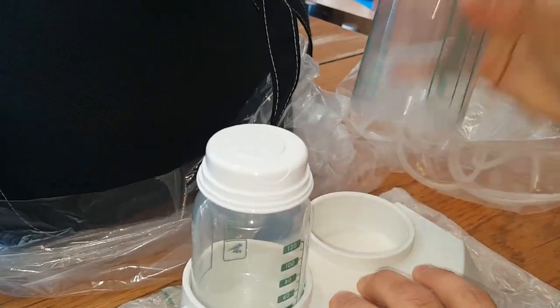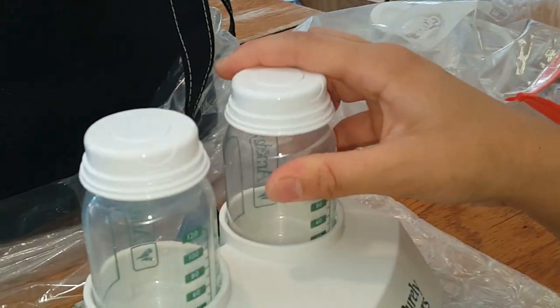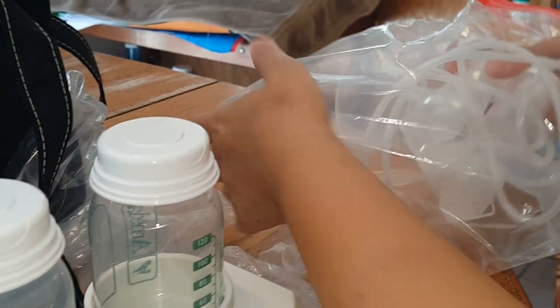So these bottles that come in the dual hygienic kit system will fit right into the slot there, so it works out really nicely.